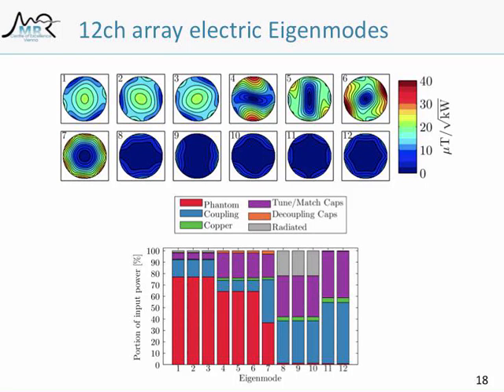So of course, you don't have 12 coils that generate orthogonal fields. You will always get a lower number of usable modes, but for that case it's really bad, because basically what you get is only half the number of usable channels, and that, as we will come back to a little later on, will also impact the parallel imaging performance.